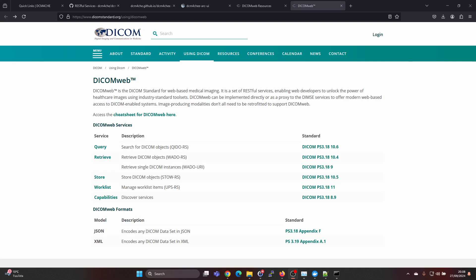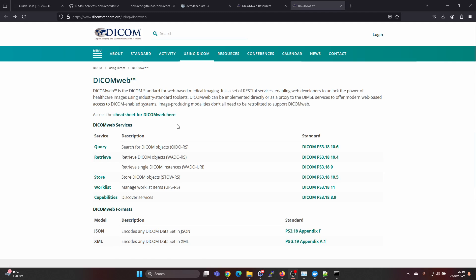Hey guys, in this quick tutorial of DicomWeb I'm going to show you how you can use the DicomWeb interface with Postman.